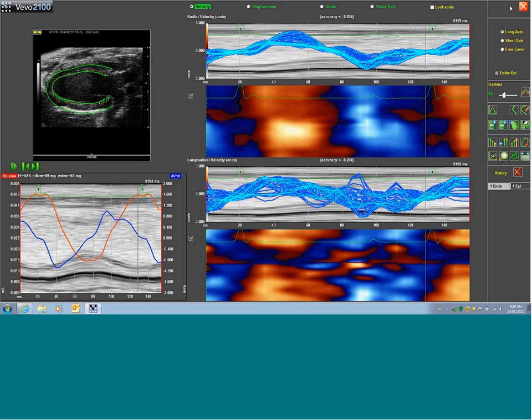There's one question that I saw from the audience that we'll have to follow up on. It was a little unclear, asking about apical views, so I think it would be better if Stephanie followed up with you directly on that one. Just looking to see if there are other questions coming in.